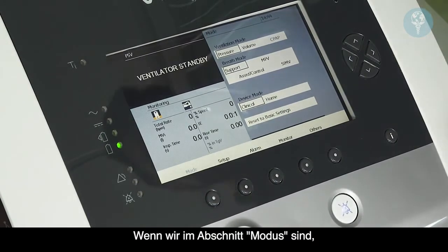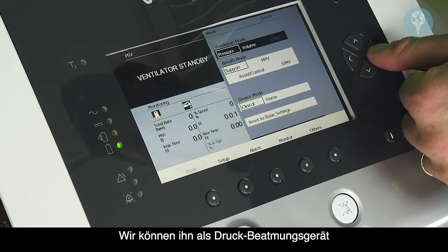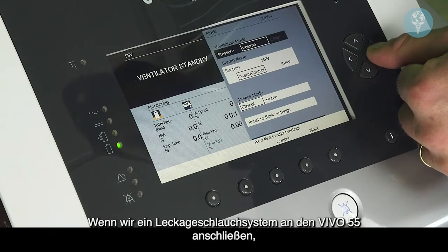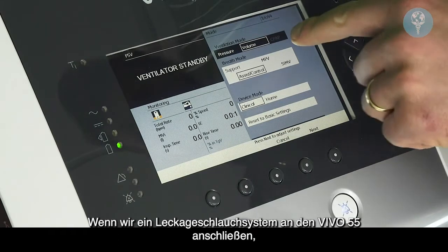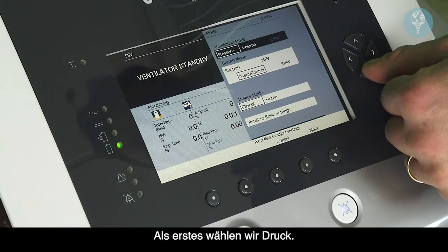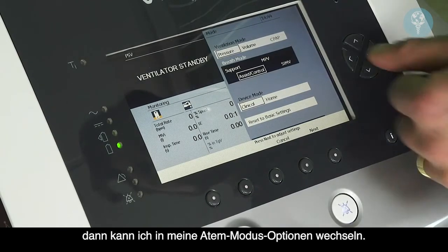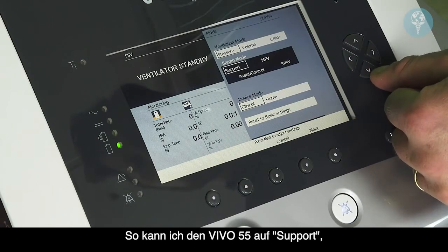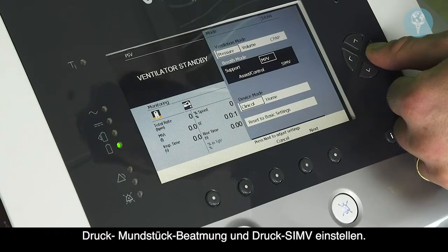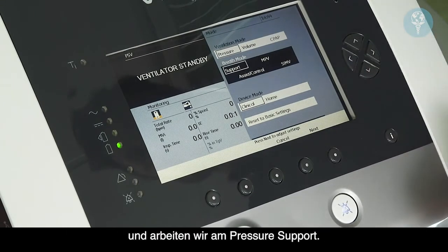Now, when we're in the mode section, we can set the Vivo 55 firstly into a ventilation mode option. We can use this as a pressure ventilator or a volume ventilator. If we have a leakage circuit attached to the Vivo 55, you can see we can set the device into a CPAP function. So let's start by going into pressure, and then if I press down, I can then get into my breath mode options. So I can set the Vivo 55 into pressure support, pressure assist or control, pressure mouthpiece ventilation, and pressure SIMV. So let's just go back to the beginning and we'll work on pressure support.